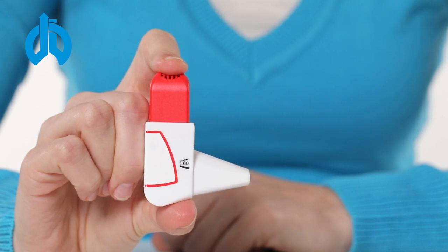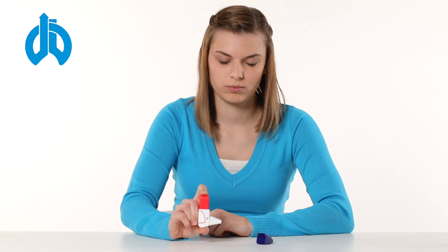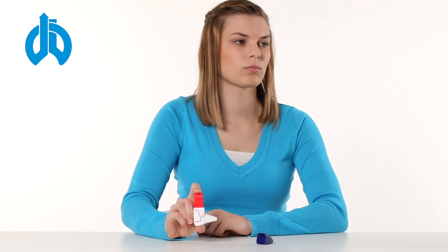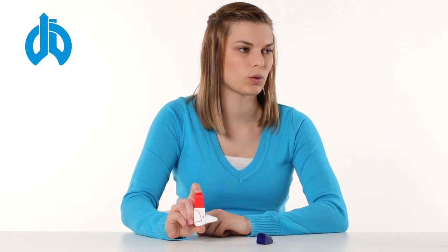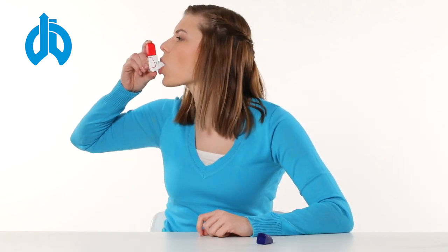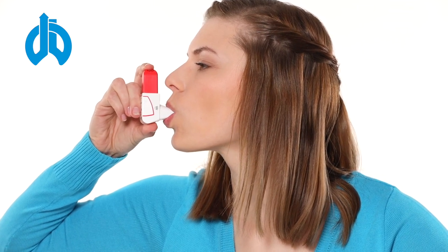Sit or stand in an upright position. Exhale, but not into the inhaler. Put the mouthpiece into your mouth and enclose it tightly with your lips. Breathe in vigorously and deeply through your mouth.